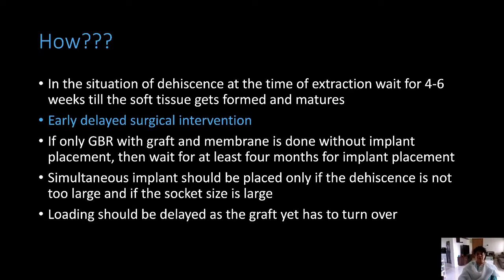Secondly, you need to remember that if your socket is large, and in that socket a smaller diameter implant can be stabilized and you still have the mesial and distal walls of the bone which are open, only then is your graft going to get turned over into bone. Let's talk about maxillary lateral incisors: you extracted a tooth, there was a dehiscence. After 4 weeks, you open it again and the buccal dehiscence is going to be taken care of with membrane and graft. But the socket is smaller in size and normally you don't have much bone on the palatal aspect in lateral incisors to fix an implant. If you still place an implant simultaneously and the periphery of the implant is very close to the buccal bone, then the graft will not turn over.